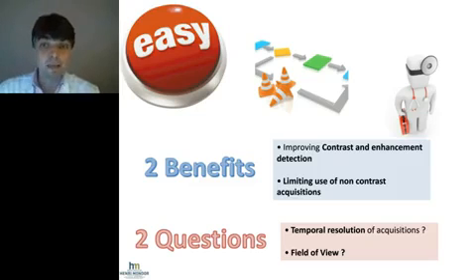The second thing is, if you're going to integrate that in the workflow, well, what's the field of view where it's actually possible to make spectral imaging? We're dealing with patients with large body habitus. And if we're dealing with patients with oncology, we have to make thorax, abdomen, pelvis acquisition, even in relatively large patients. That means that the field of view has to be pretty much standard in spectral imaging, and there has to be no limit in the field of view. And with that in mind, then we can move on to actually clinical practice.